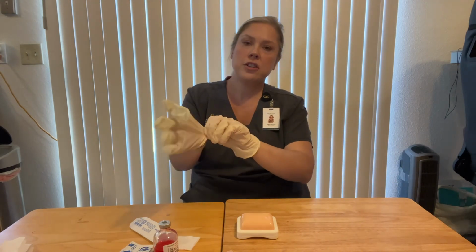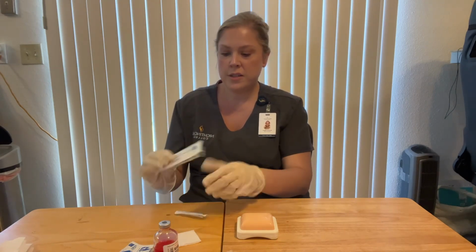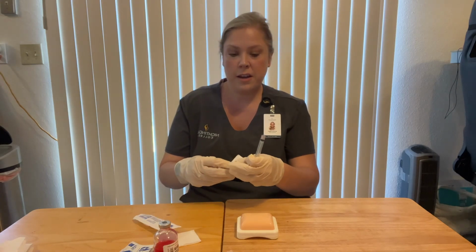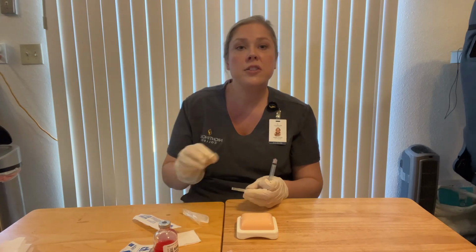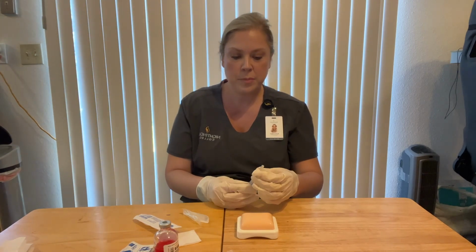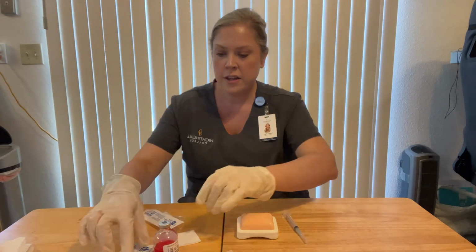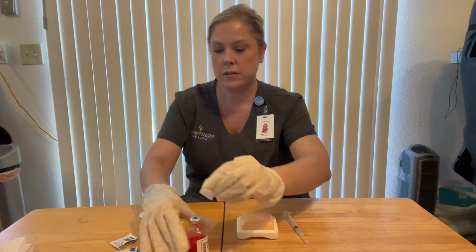And then I want to make sure I have the right needle and syringe. So today I have a 3 ml syringe. And then for the sub-Q injection, I have a 25 gauge 1-inch needle. Normally I'd want to use a 5/8 inch needle for a sub-Q injection. It really just depends on your patient. We're going to attach that. And then we're going to want to take an alcohol prep pad and clean the top of the vial.